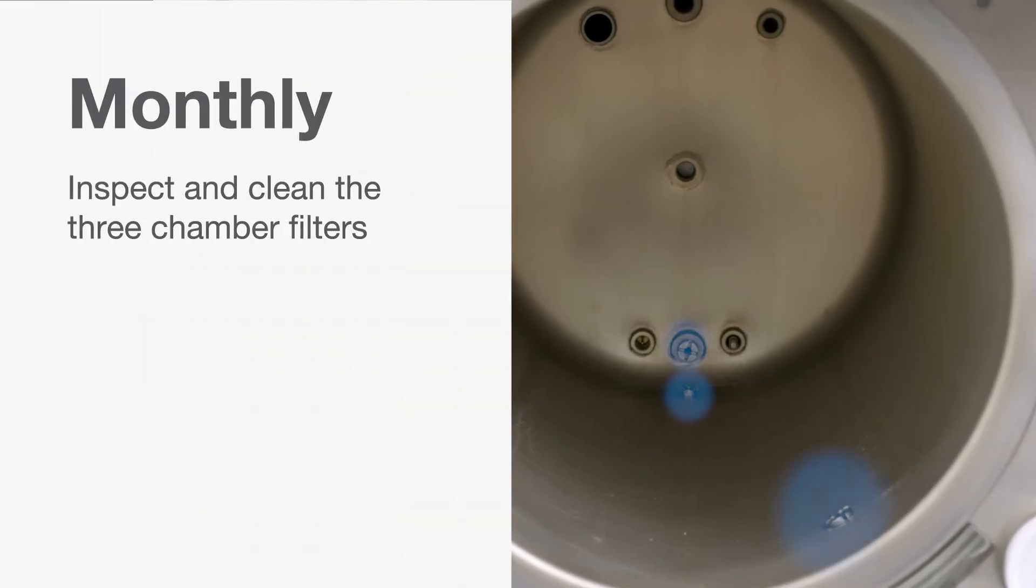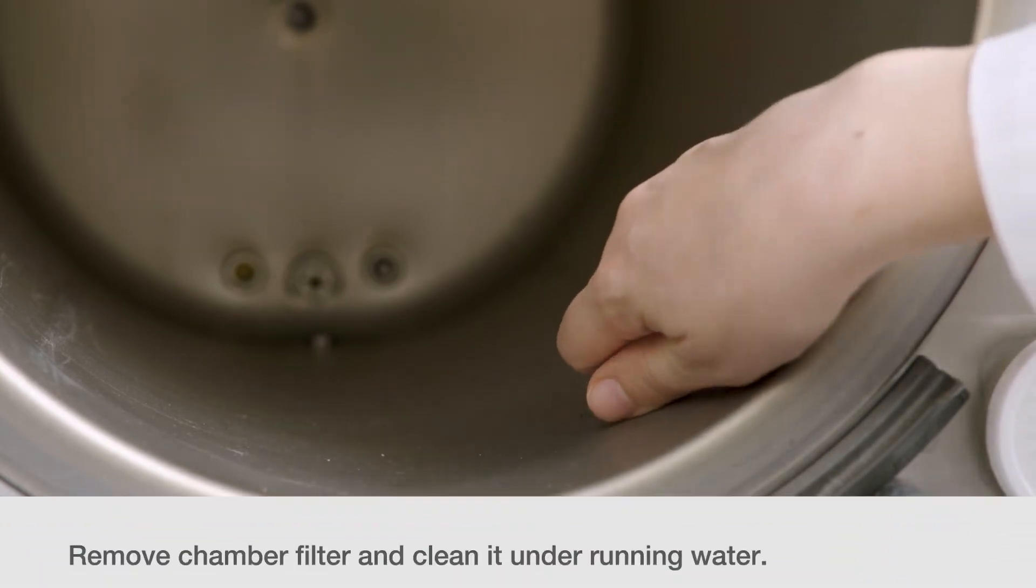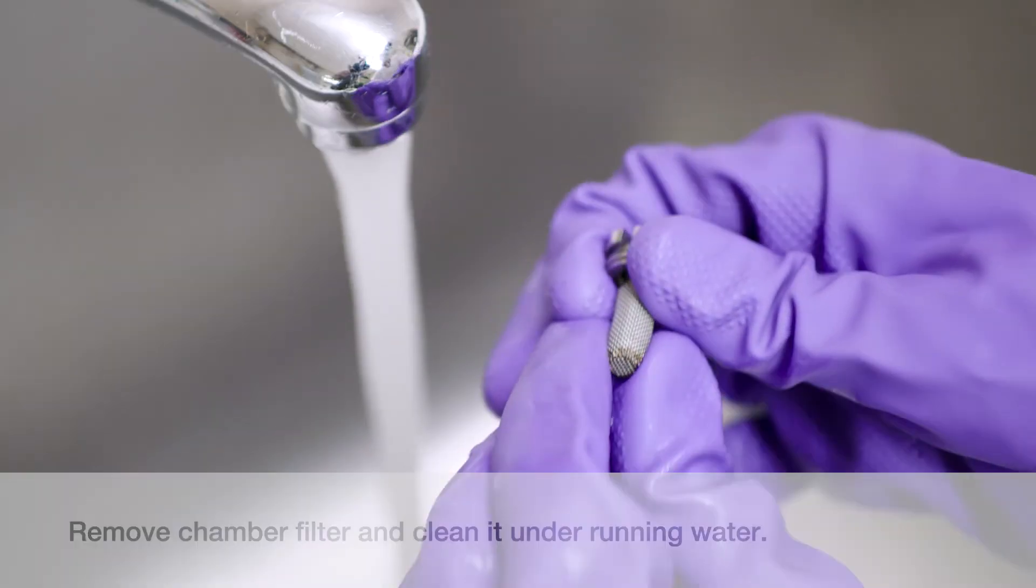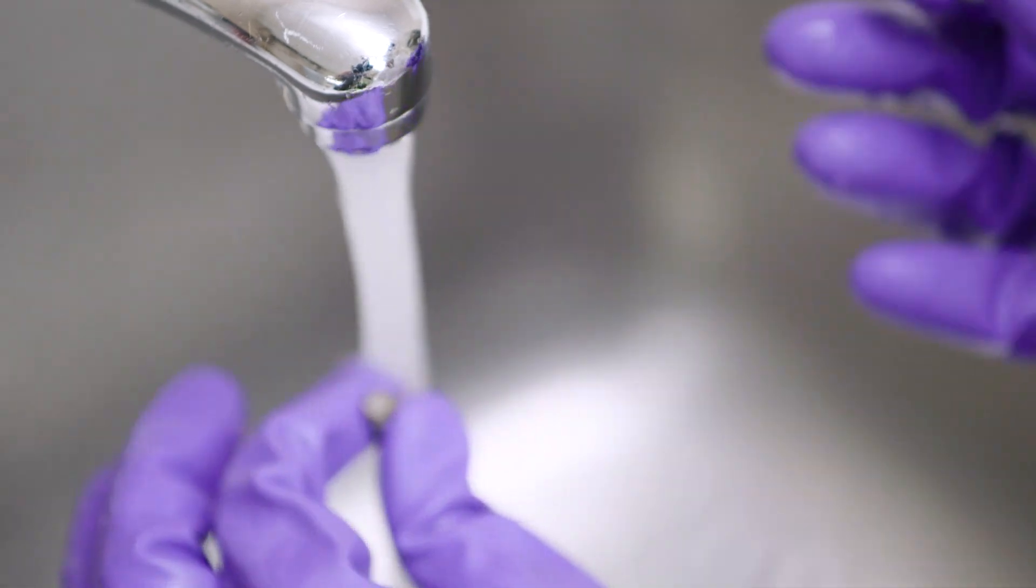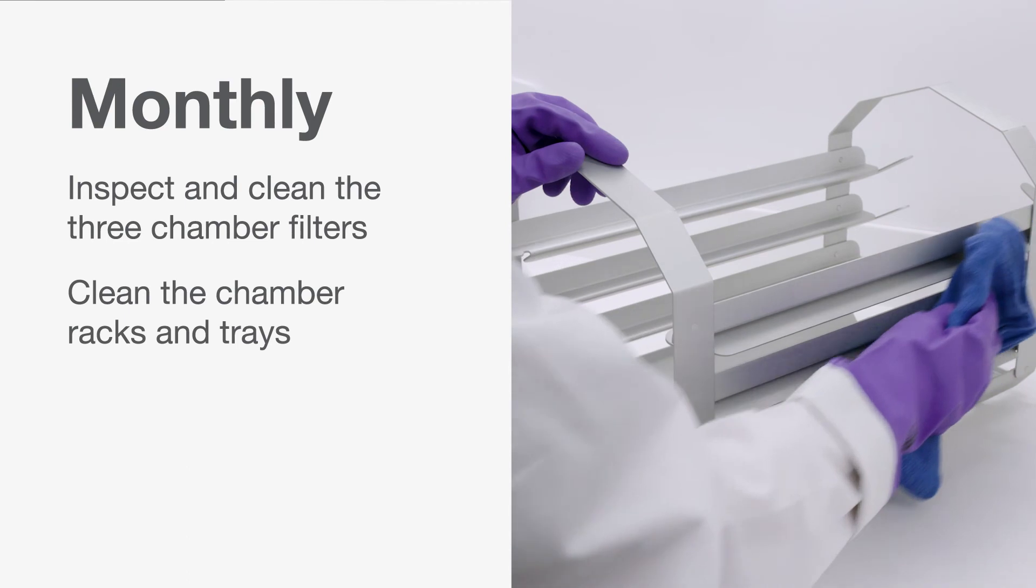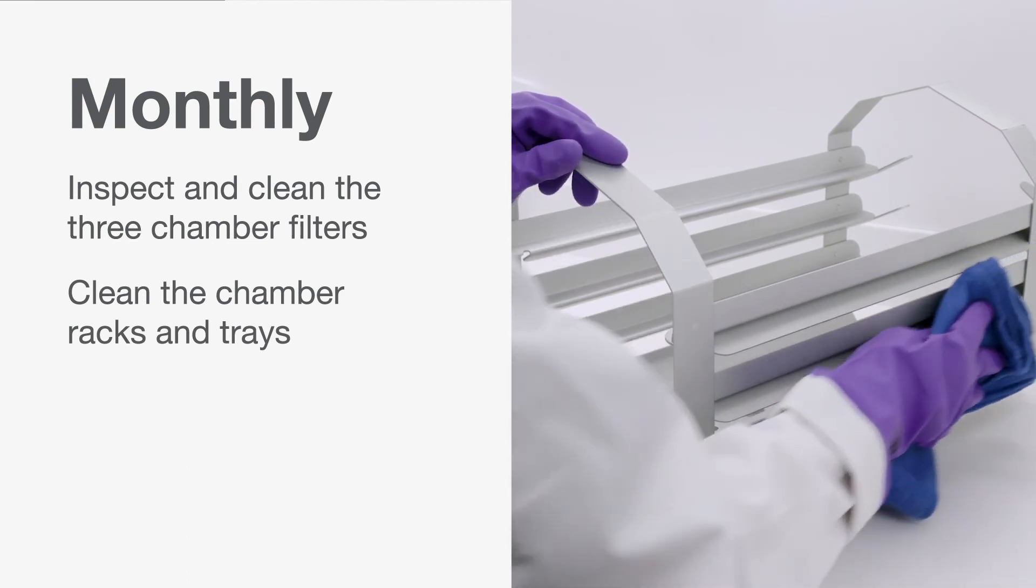Every month, inspect and clean the three chamber filters. To do this, remove the chamber filter and clean it under running water. Clear the mesh of debris. If the debris cannot be removed, replace the filter. Clean the chamber racks and trays every month with a lint-free, water-dampened cloth.